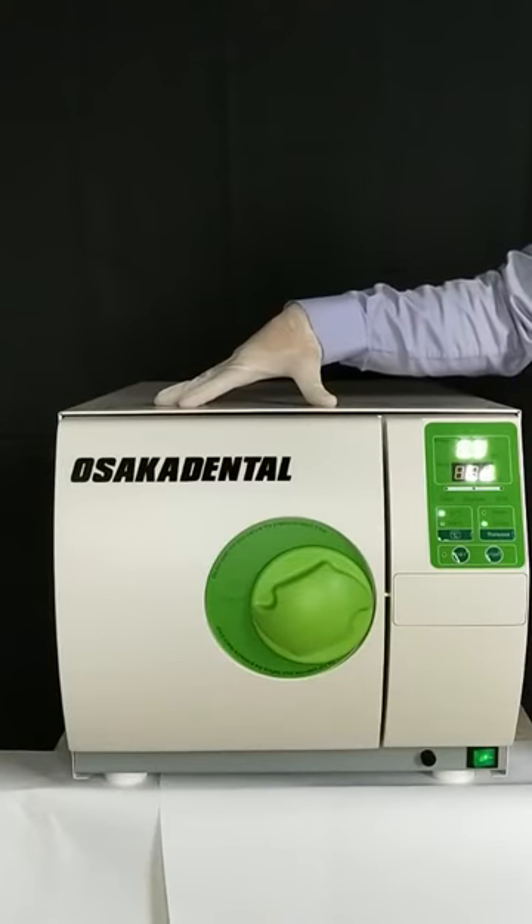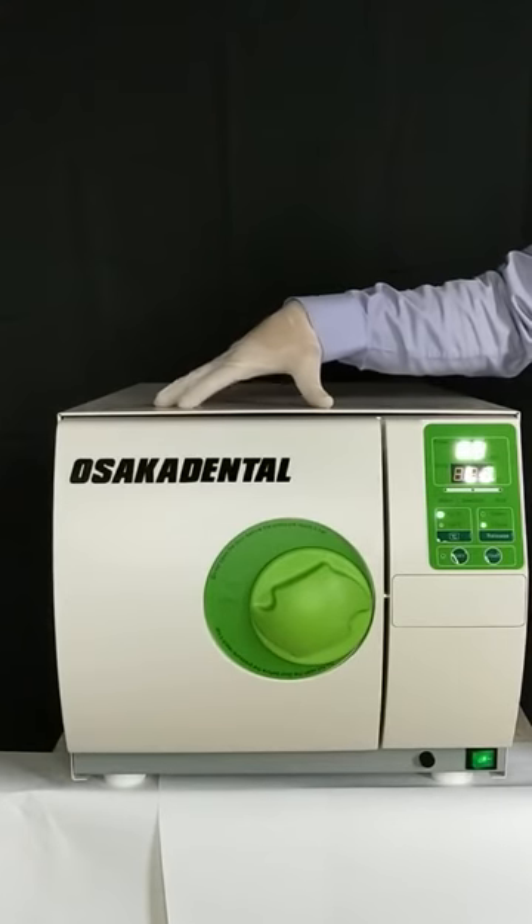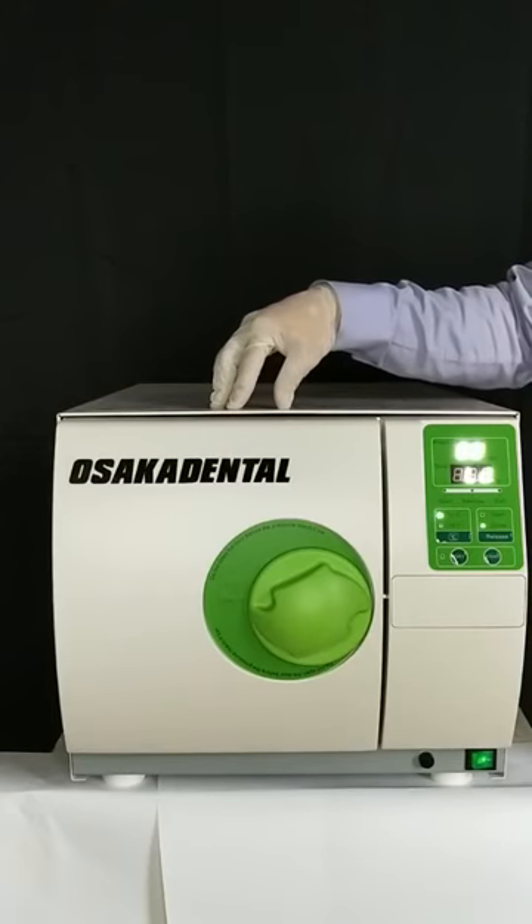This is your STEAM Sterilizer, an N-Class autoclave designed for solid unwrapped load sterilizations. It is entirely produced according to the European standard EN 13-060 for tabletop sterilizers.